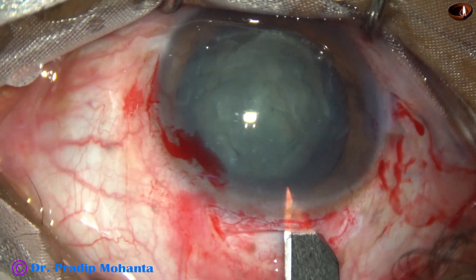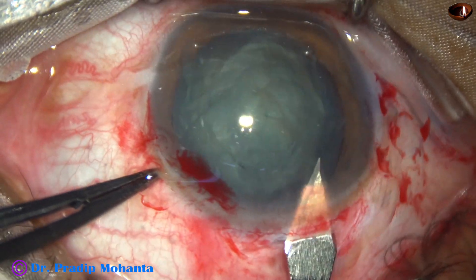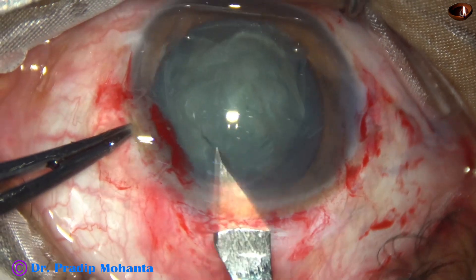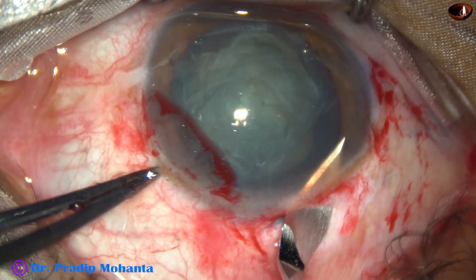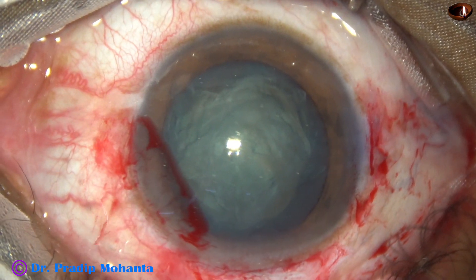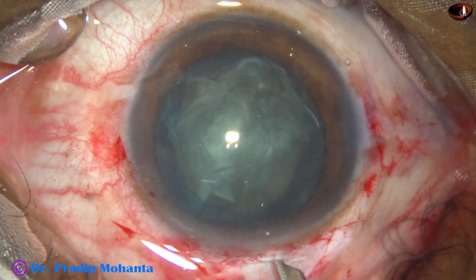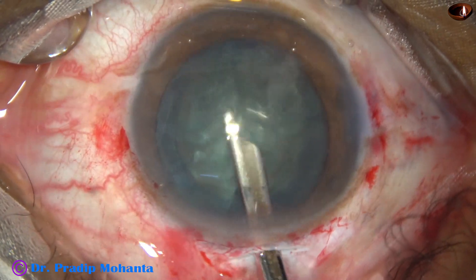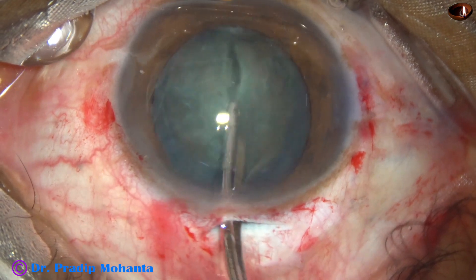Now the sclerocorneal tunnel is opened. The outer opening of this tunnel is 4 millimeters and the inner opening is about 5 millimeters. The cortical matter is removed for better visibility.